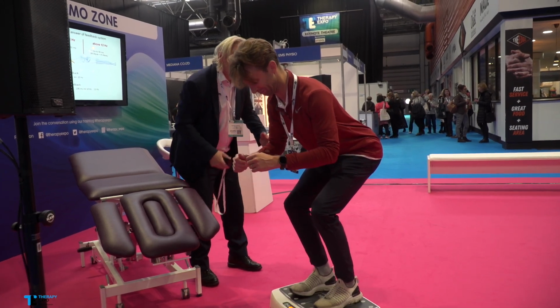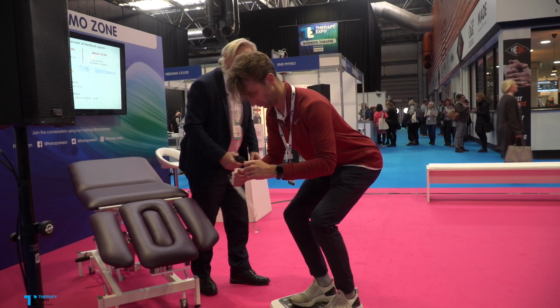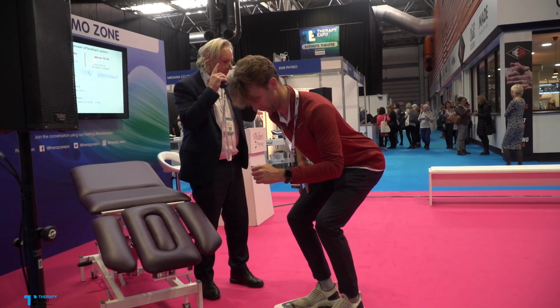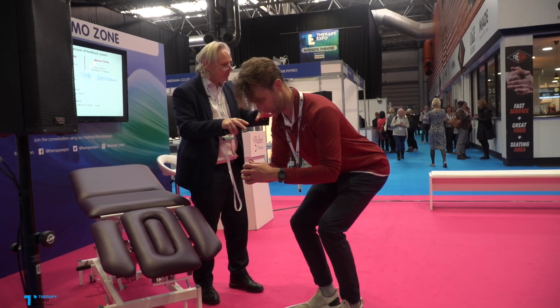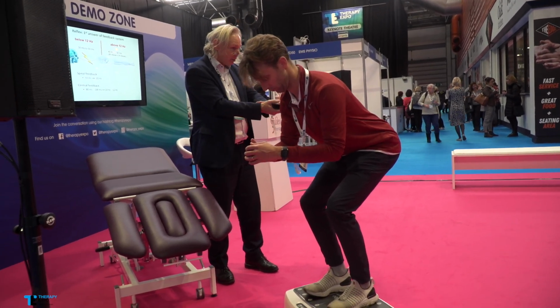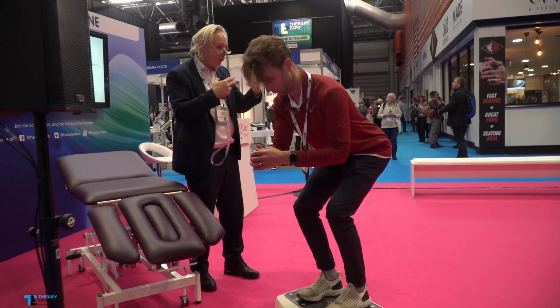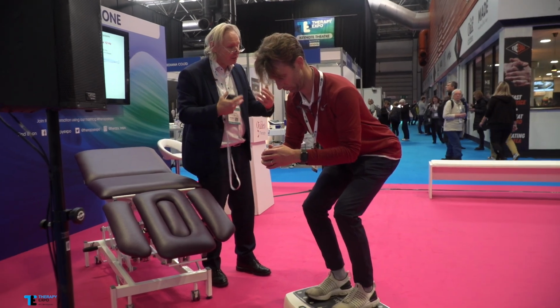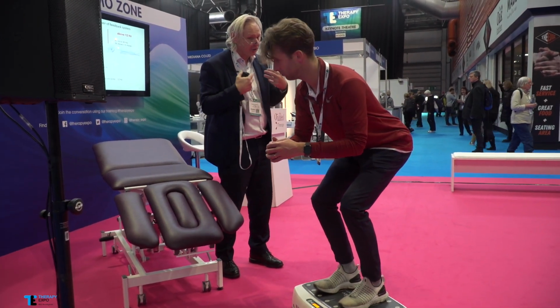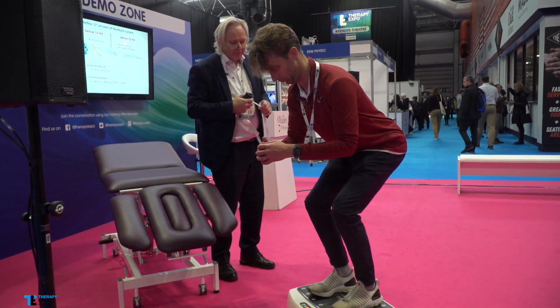Good. And if somebody wants to feel, it's really now tight muscle. But, and this is very important again in rehabilitation, we can work on the muscle in the neurological system without affecting the heart. Heart rate stays normal and lung function stays normal. So there's no impact on the cardiovascular system. This is very important, that we can train the high muscle power without affecting the cardiovascular system. And we do this now for 1 minute.